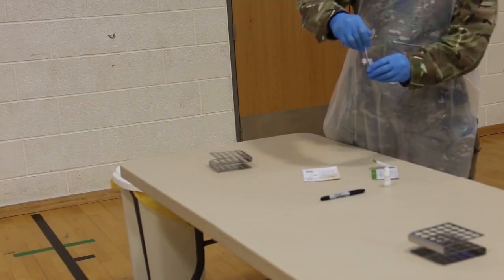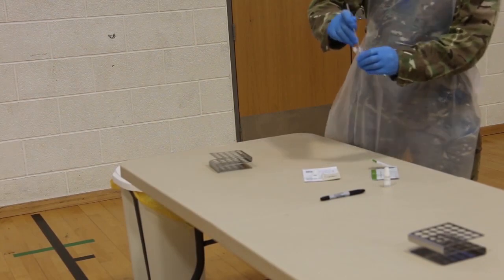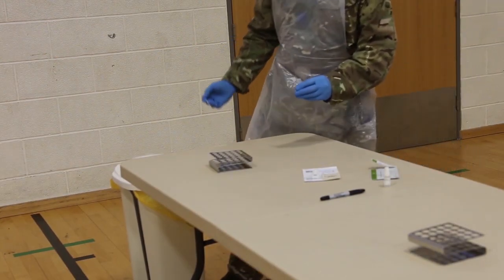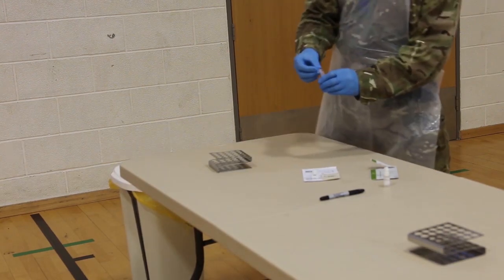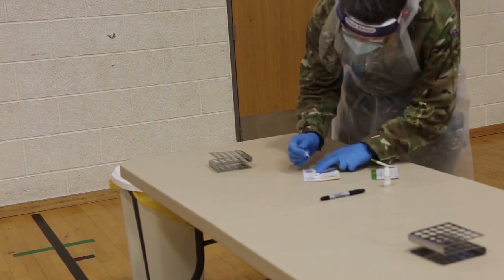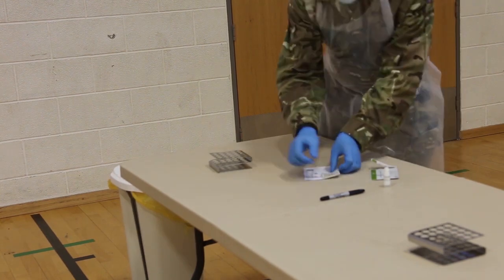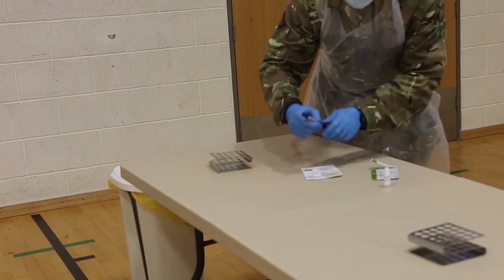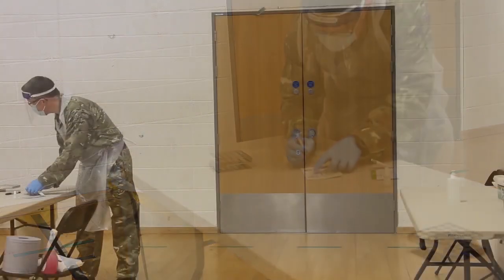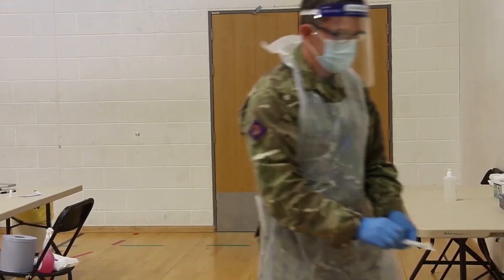When your test processor is given your registration card by your test supporter, they will attach one of your unique barcode stickers to the individual plastic test stick. Each test tube and test stick is only used once so that we can be sure your results are accurate. They will gently stir the swab in the solution, then put 2 drops of the solution from the test tube into a plastic stick. The test processor will write the time on the plastic test stick and put it safely on the table behind them.